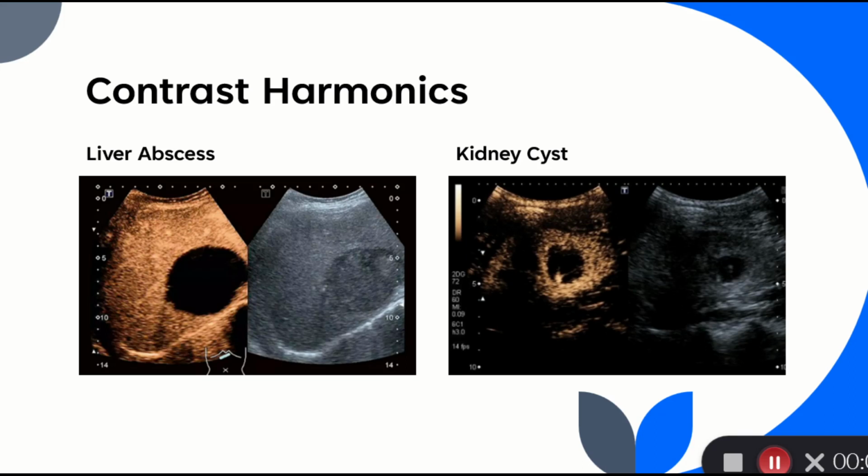Harmonics are used in ultrasound because they help improve lateral resolution and reduce artifacts in the near field. They help create a better quality image, and they aid in the visualization of borders. Contrast harmonics are created when sound interacts with the contrast agents. They create very strong harmonics. Contrast harmonics are created during reflection. The sound interacts with the gas bubble, and since contrast agents react in a nonlinear behavior, this is what creates the harmonics.